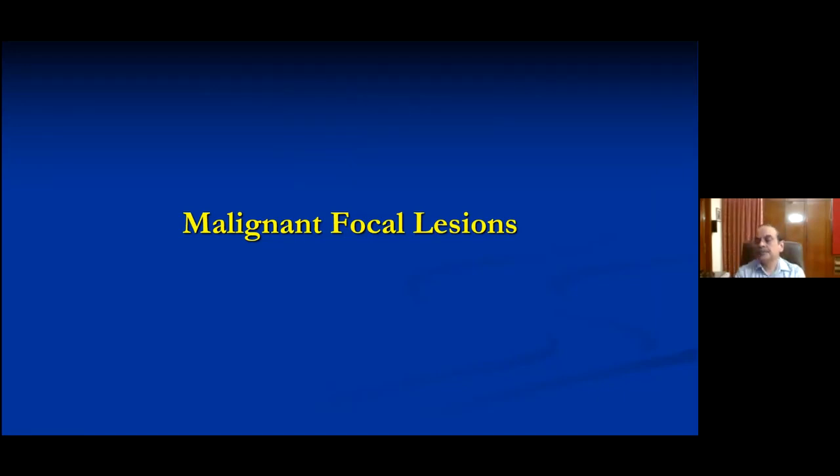Professor Raju, there are so many questions and you evoked such a strong response from so many people, and I'm going to try and filter and reach some of them because it's going to be a class of its own if I try and finish all of them. So let me ask you some of the questions which have been asked by the audience. First is from Suprabhat Giri from Mumbai. His question is, how do you differentiate hepatocellular adenoma from HCC?